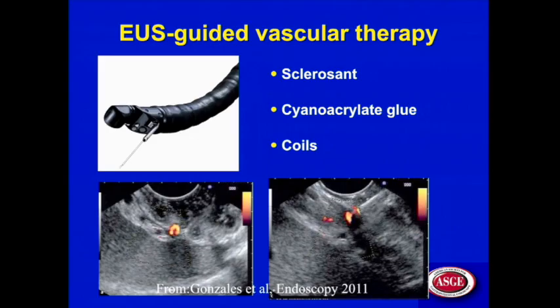EUS-guided vascular therapy is an extension of what we really do every day. We identify tumors in the pancreas, flip on the Doppler, look for vessels, and identify them. Then we target the lesion with our FNA needle. But now, instead of aspirating, we can inject a solution — a sclerosant or cyanoacrylate glue — or we can deploy a coil. The structure we're targeting is a vessel, within the wall or outside it.